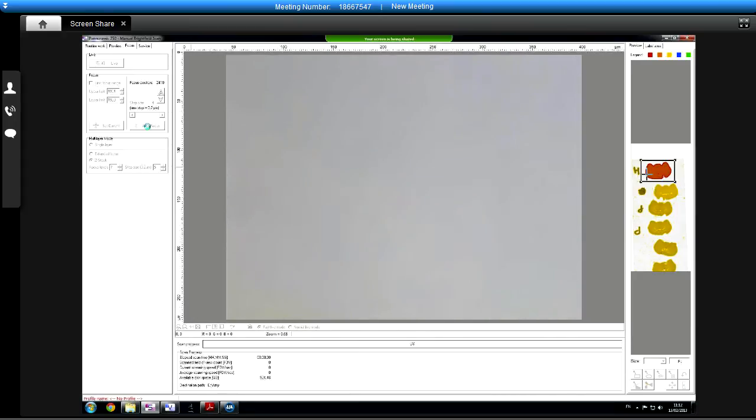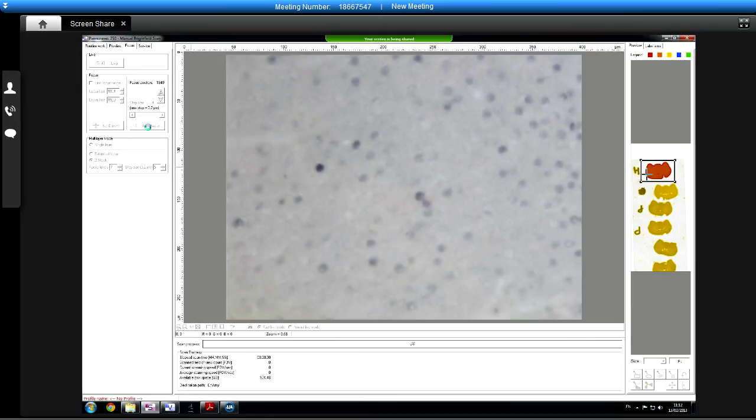So that's where it would put it itself using autofocus. So the question is how far above and below that is the useful information. So let's just have a look. I'm going to go up and down a micron at a time. So 1, 2, 3. Any more than 3 down is overkill, I'd say. 1, 2, 3 back to the middle. 1, 2, 3. Yeah, so about 6 microns.